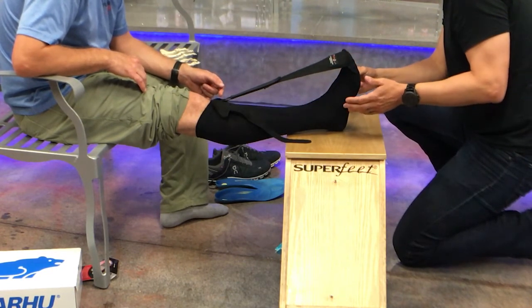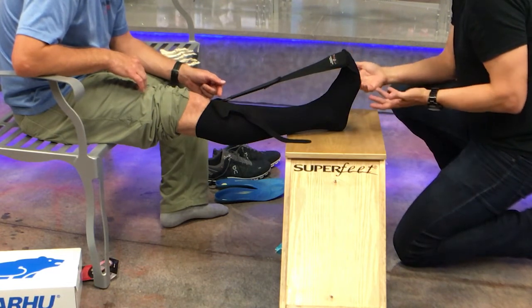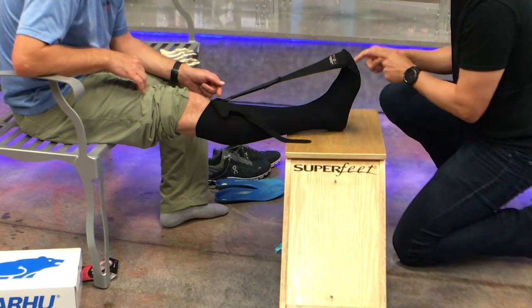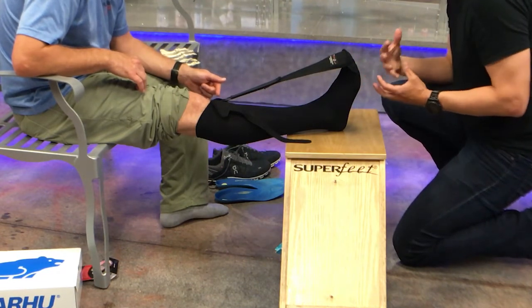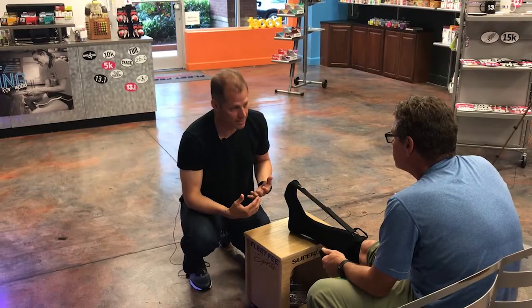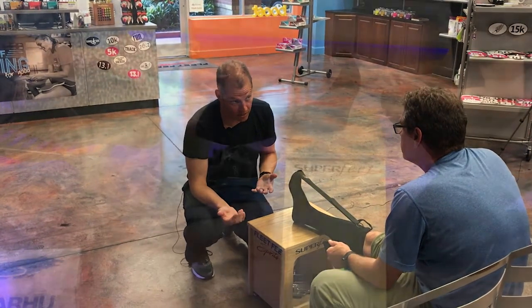How long should I wear it? You're going to probably see some benefit within the first couple nights. Should I take it off then? It's gradual. You're going to want to continue to wear it because that tearing that's taking place in that plantar fascia is going to be happening over time on an almost undetectable level. You want a history of healing, so you're going to want to wear it until you've been pain-free for seven mornings.